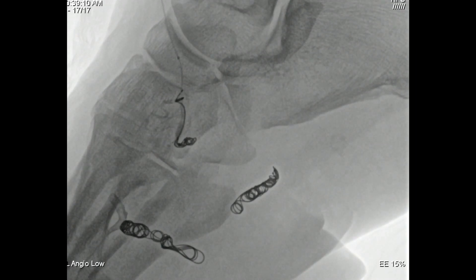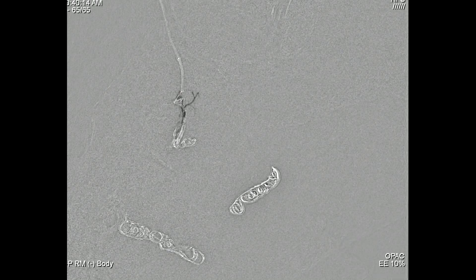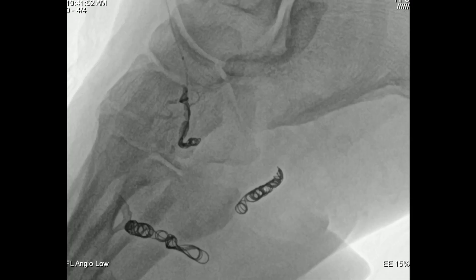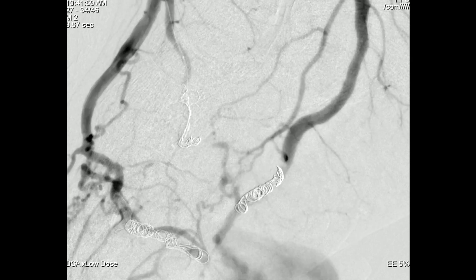Having learned that lesson, we opted to put onyx in. The onyx injection is speeded up in the video for the sake of covering all the content, but this is a slow and steady process — not something you should use unless you've used it before. It's only approved for neurovascular use, but in my opinion it's still the agent of choice for peripheral arteriovenous malformations. Using the roadmap function you can subtract out the old onyx and see the new onyx going — it's a very useful technique.